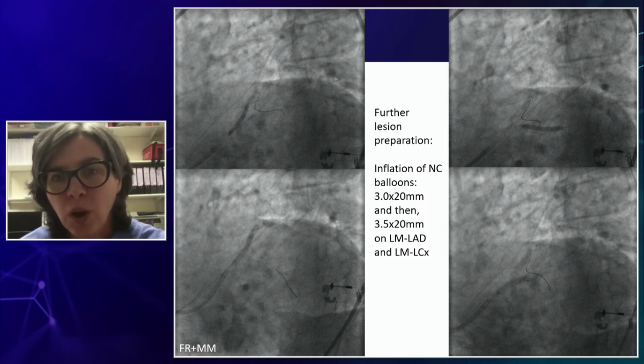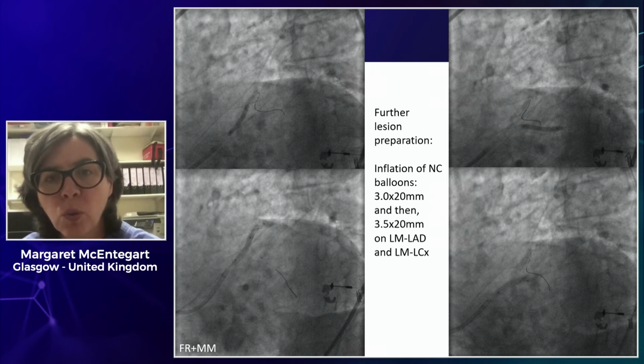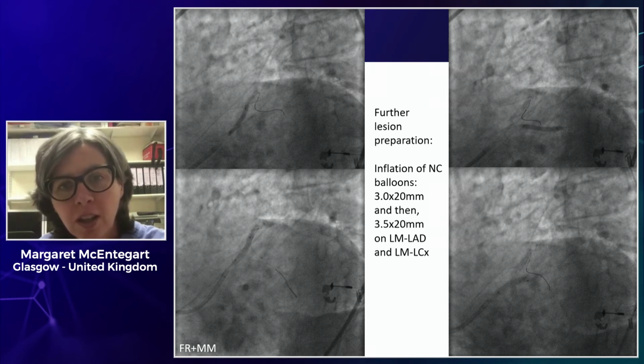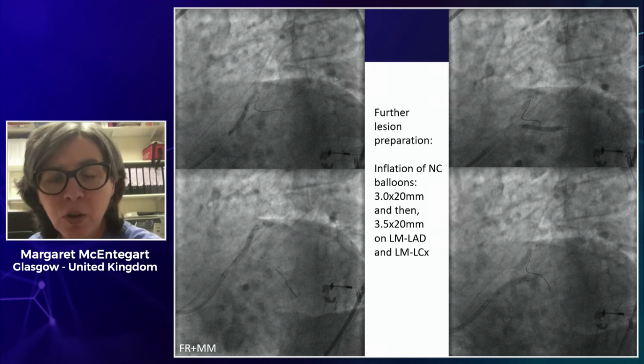So what I tend to do is, as you've suggested, I usually will IVUS and look for fractures and look for debulking. And then what I almost always do is one-to-one predilatation with a non-compliant balloon. So one-to-one vessel-sized non-compliant balloon, and look at the expansion of the balloon in a couple of orthogonal views to make sure there's no waist in the balloon. And then, depending again on the specific case, if I'm happy with that, if I've IVUS after the rota, I'll then go on and do my stenting.